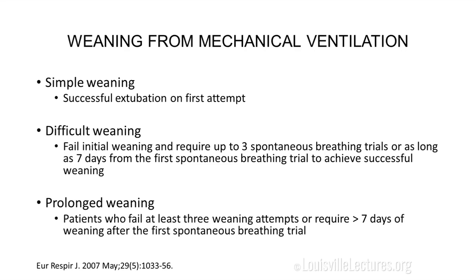Difficult weaning means a failed initial weaning and requiring up to 3 spontaneous breathing trials or as long as 7 days from the first spontaneous breathing trial to achieve successful weaning. And prolonged weaning is patients who fail at least 3 weaning attempts or who require more than 7 days of weaning after the first spontaneous breathing trial.